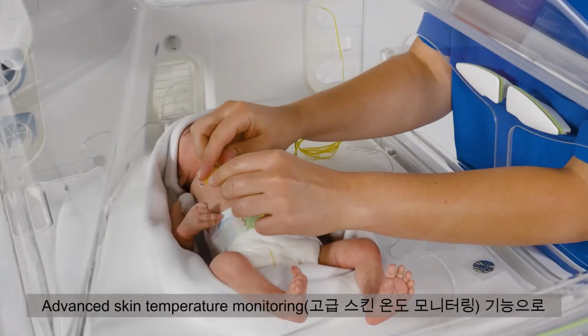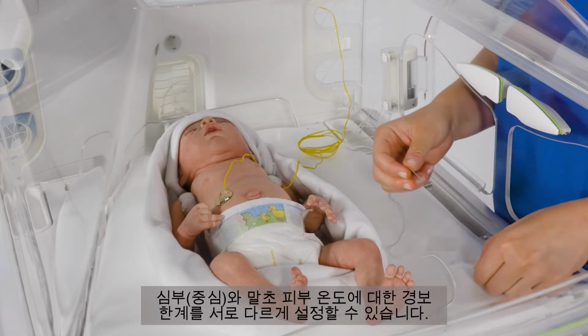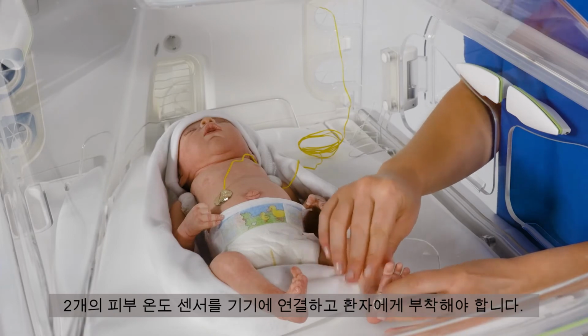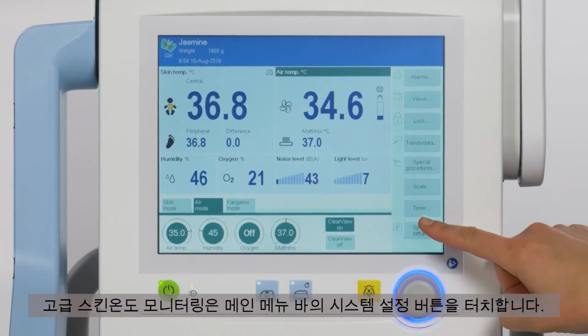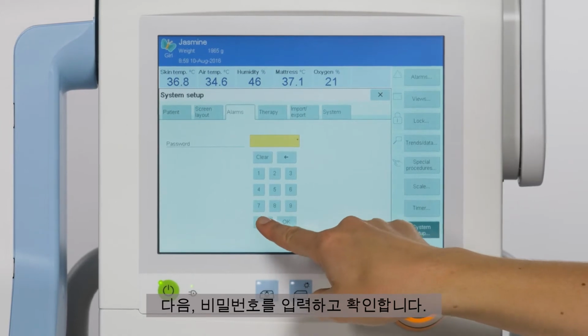With the advanced skin temperature monitoring function, the alarm limits for the difference between the central and peripheral skin temperature can be defined additionally. The two skin temperature sensors must be connected to the device and attached to the patient. Activate the advanced skin monitoring by touching the System Setup button on the main menu bar. Open the alarm screen. Next, enter the password and confirm.